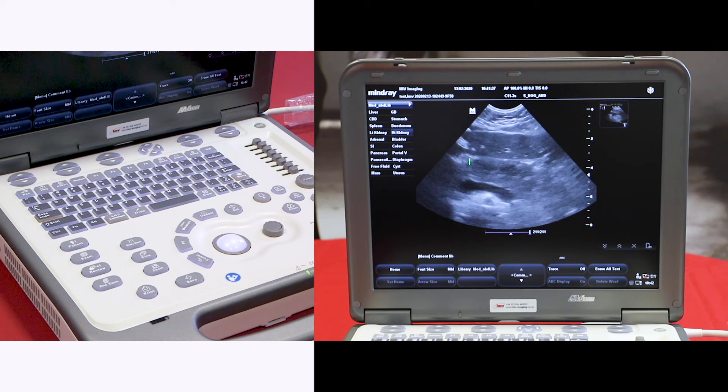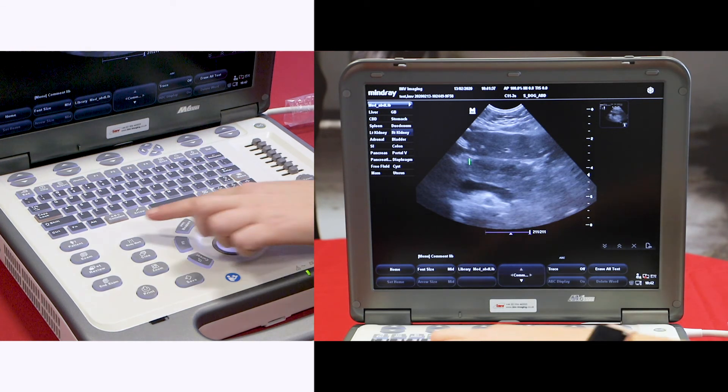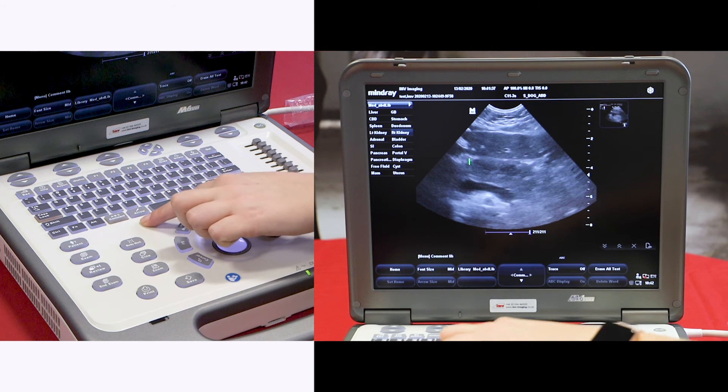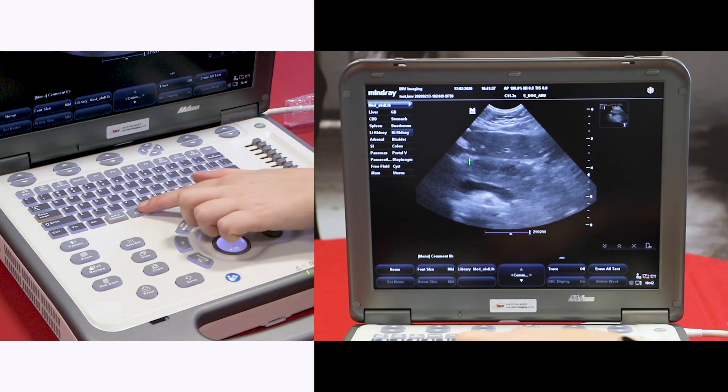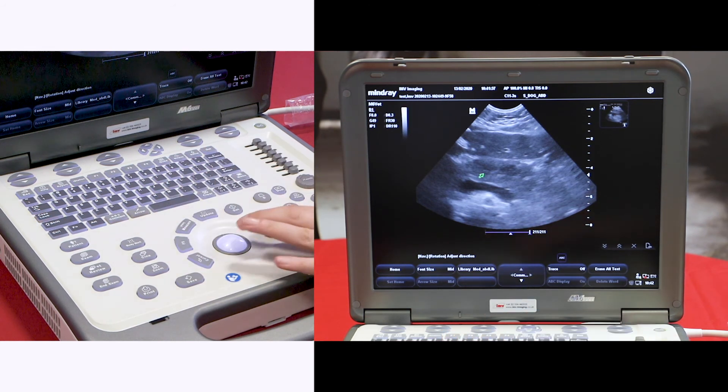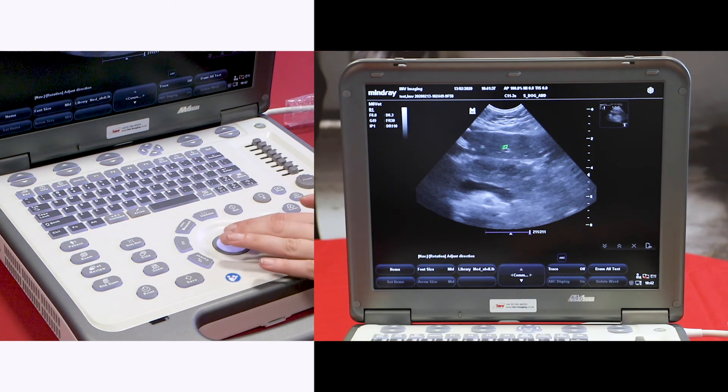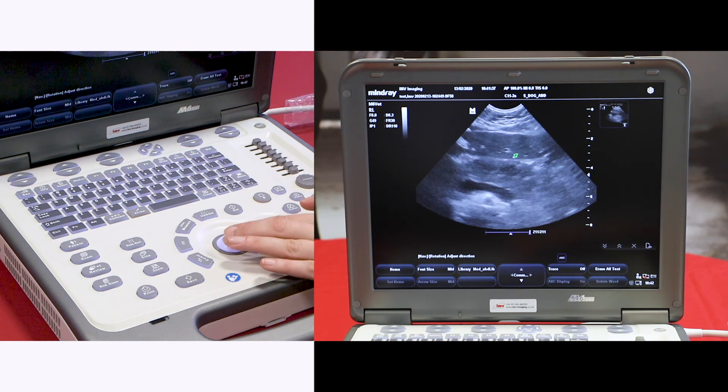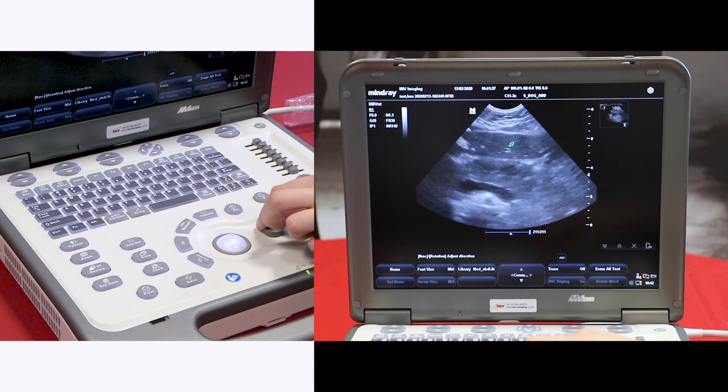You can also add an arrow just to the right of the comment button. You can move this around with the trackball, or use this button to change the rotation of the arrow.